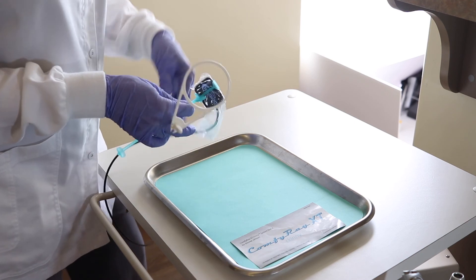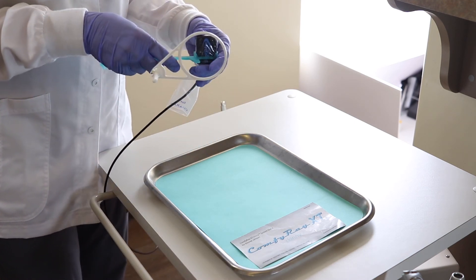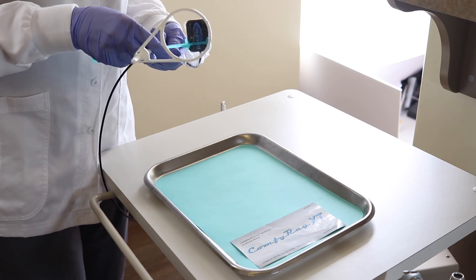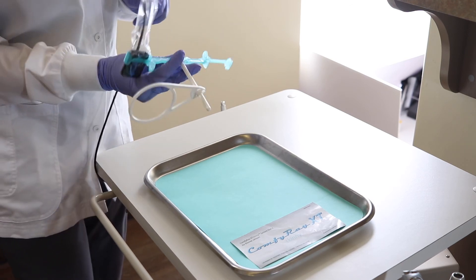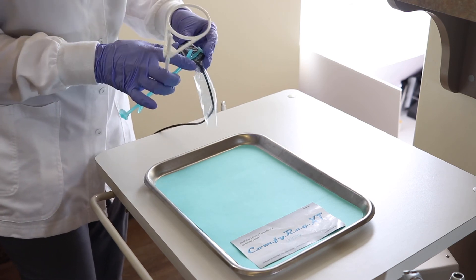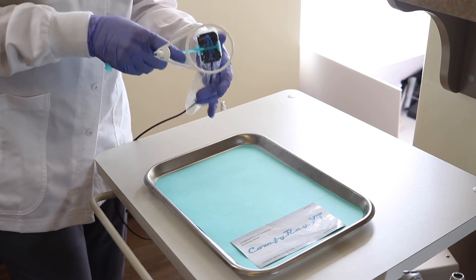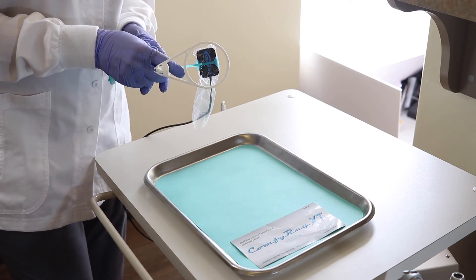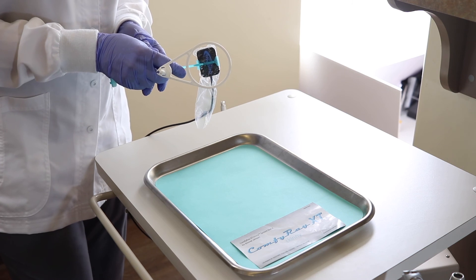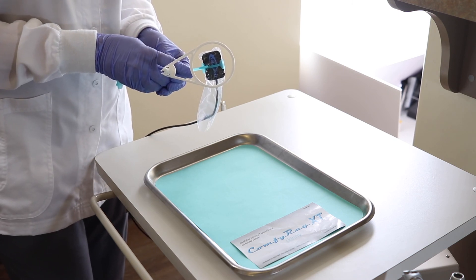You will click this all the way to the top and slide your sensor all the way up, and you will take three upper anterior shots and three lower anterior shots. And if you would like to do a vertical bite wing, you slide this in the middle and position the ring in the middle. And that is how you do a complete full mouth x-ray using the ComfyRay XT Skinny with your Dentimax sensor.